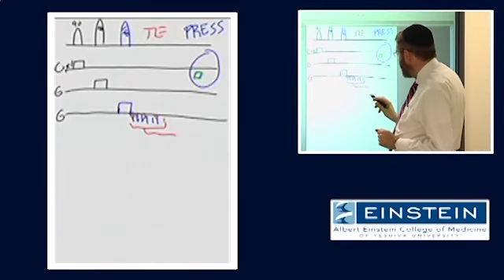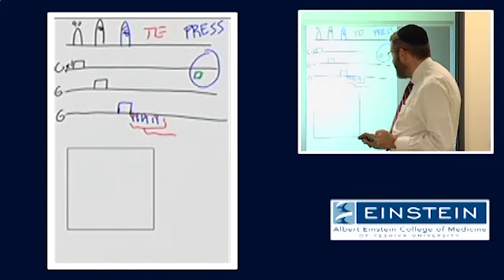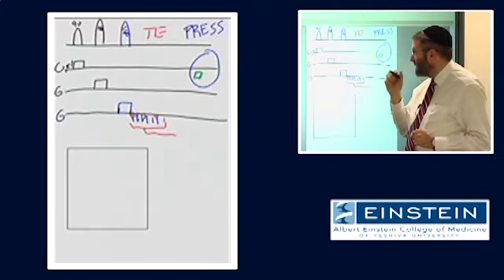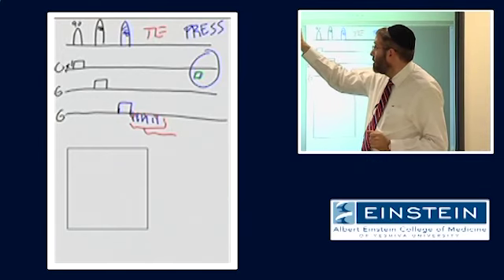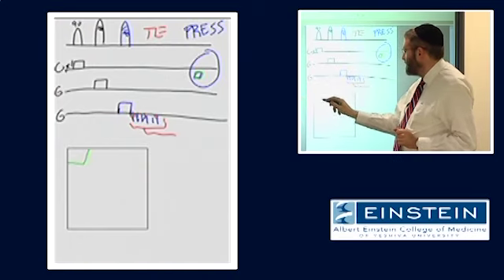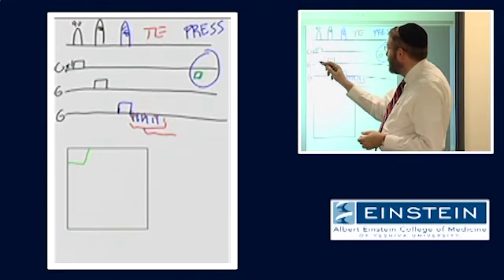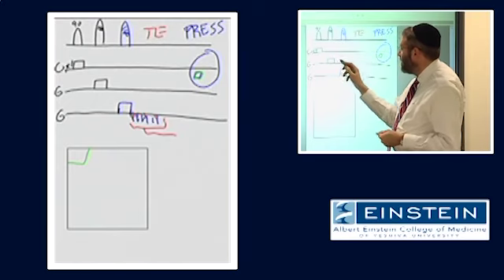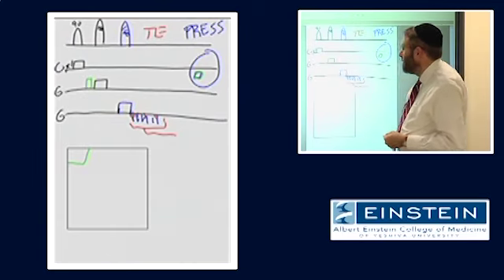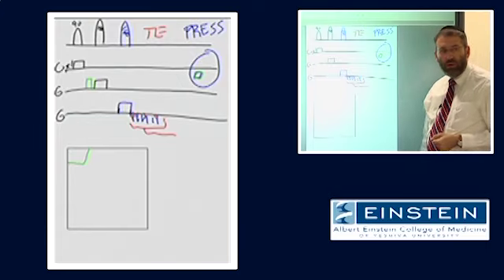If we change this pulse sequence now, so we think about what's happening with our data. This information essentially allows us to say something about only a single point in space. What if after we do this once, we iterate it a second time, this time turning on an extra bit of this gradient magnetic field, let's say between the 90 and the 180.